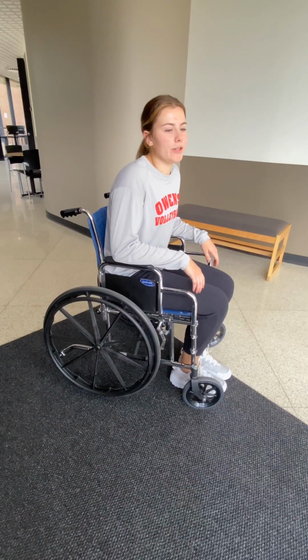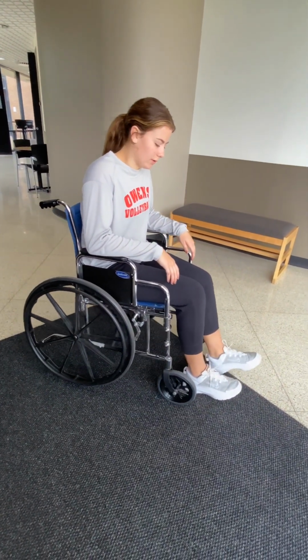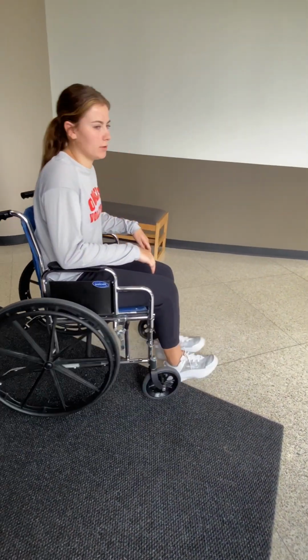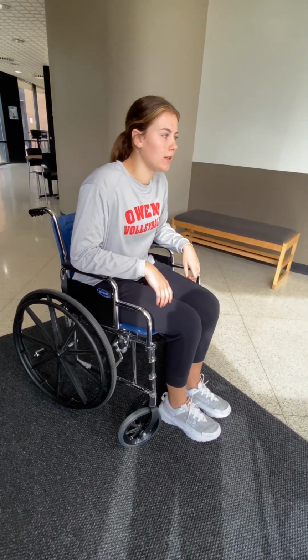Now we're going to do lower extremity propulsion. So to go forward, you use the heels and the soles of your feet. To move forward and to go back, push. Go. Now we're going to do a single upper and lower extremity propulsion.